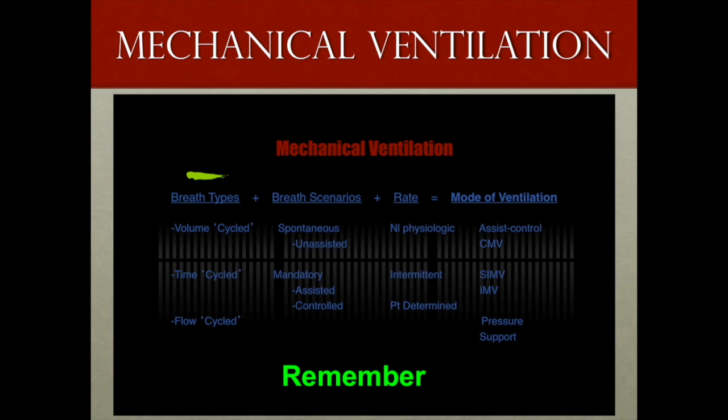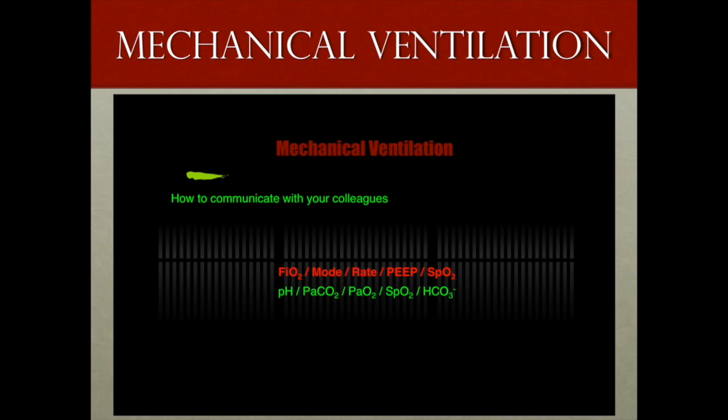So just remember when you're talking about your mechanical ventilation and when you're thinking about your modes, remember your breath types, your breath scenarios, and your rate, and by combining them in various ways, you can come up with your modes of ventilation. When you're communicating to your colleagues, generally you will say your FiO2, the mode that you're in, your rate, your PEEP, and your SpO2. And if you have a gas, then your gas parameters.